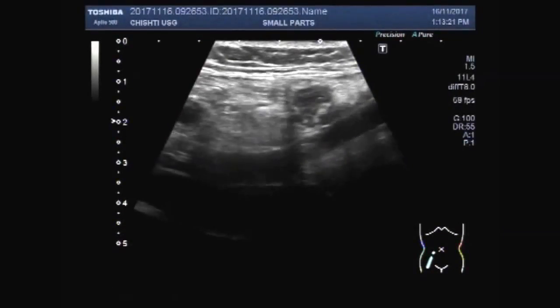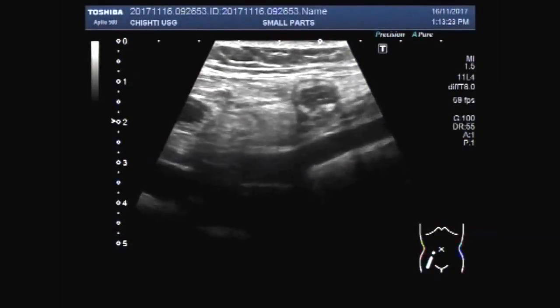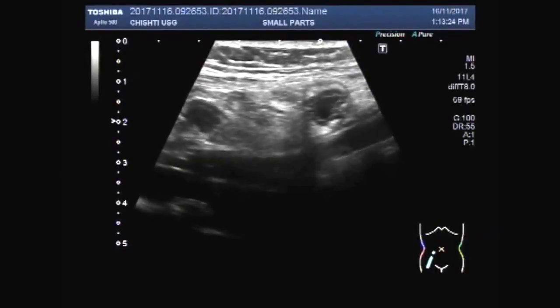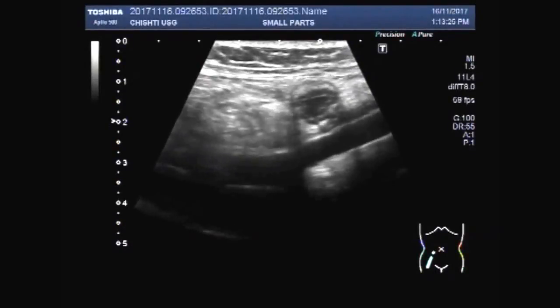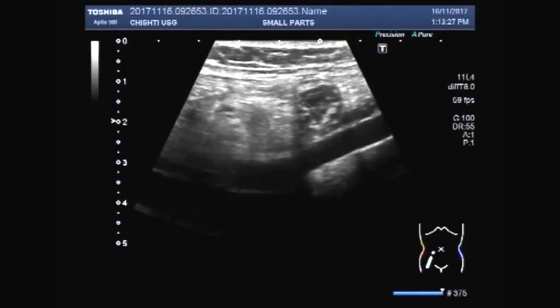Dear viewers, I hope you are all fine. This ultrasound video shows focusing of the acute appendicitis in an adult patient.